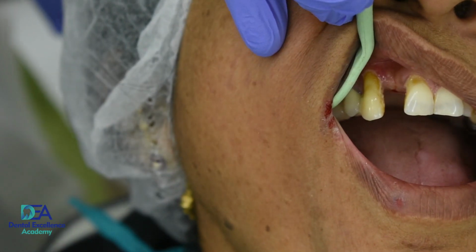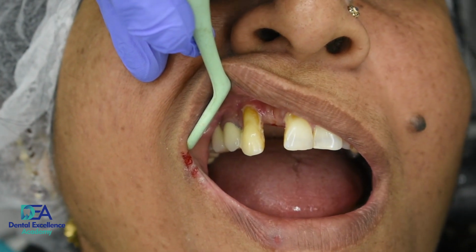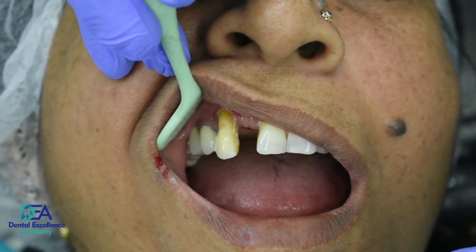Today we are placing an implant in the maxillary anterior region, that is 1 2, with immediate placement of the implant after extraction of 1 3.